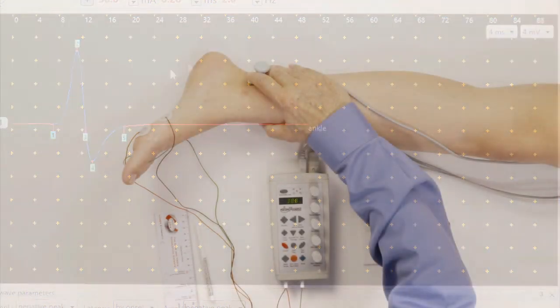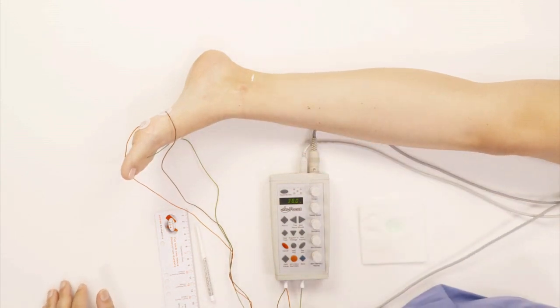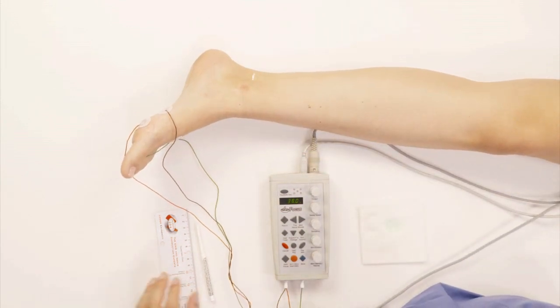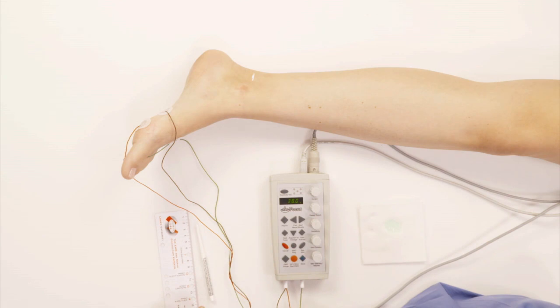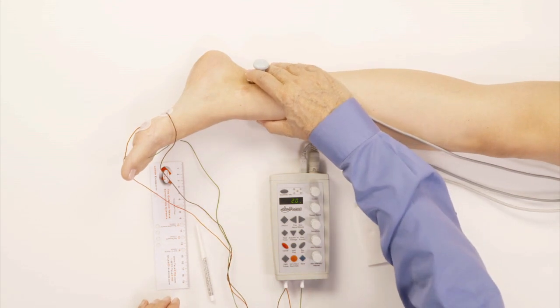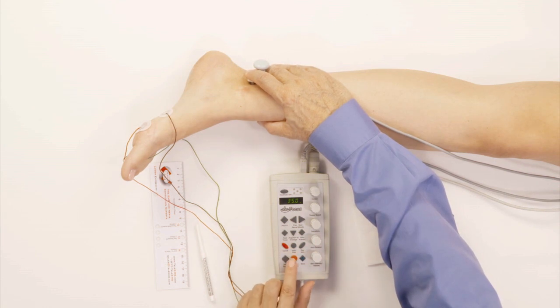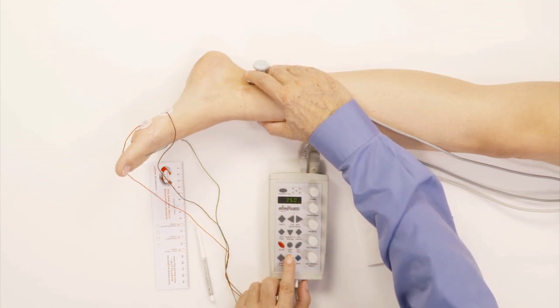The next study we're going to do is the tibial F wave. All I got to do is press next on the machine. We're going to get the F wave, which I stimulate right in the same place as I stimulated the tibial nerve. I go up on the stimulus intensity and I'm going to start stimulating.